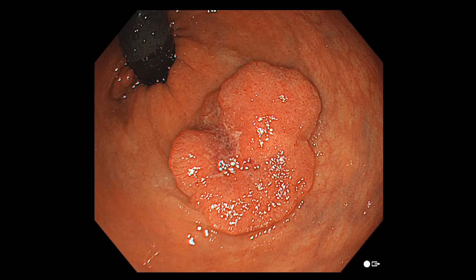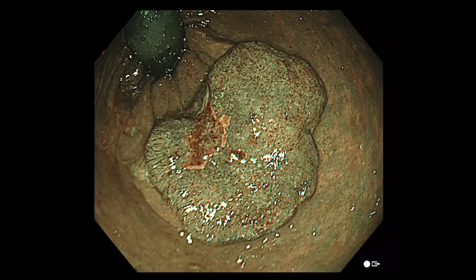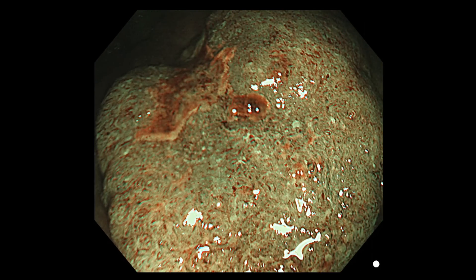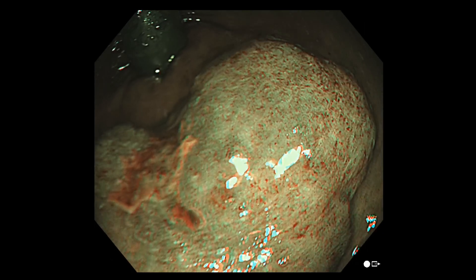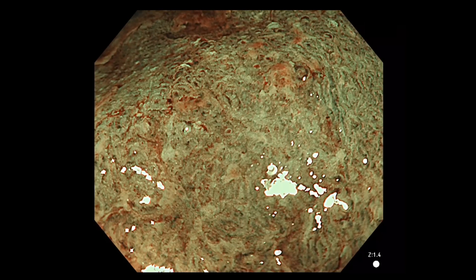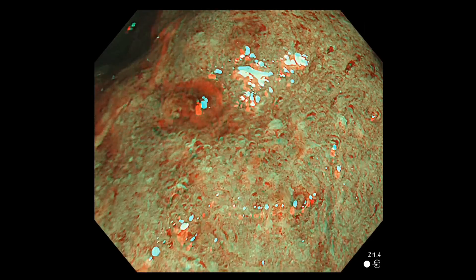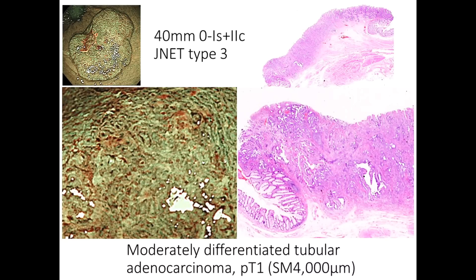This is a case in the rectum and the diameter of this lesion is approximately 40 mm. The tumour has a large thickened depressed area. This lesion has loose vessel areas and some thick vessels are interrupted. The structure of the surface is destroyed and amorphous — these features are typical for J-Net Type 3. J-Net Type 3 is an indication of deep invasive cancer, therefore surgical resection was chosen for this patient. The histopathological findings revealed moderately differentiated adenocarcinoma with submucosal deep invasion; the invasion depth was 4,000 micrometres, so the treatment was appropriate.